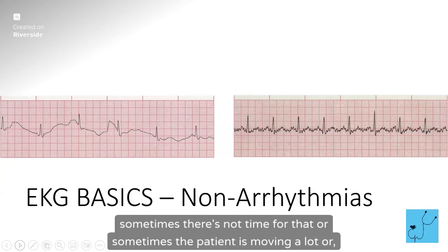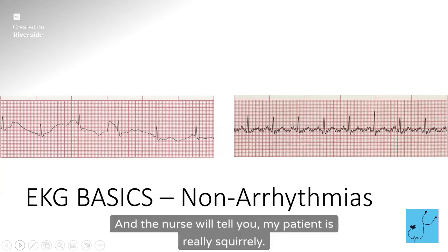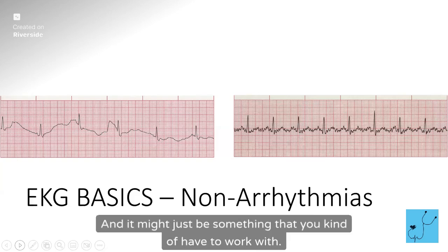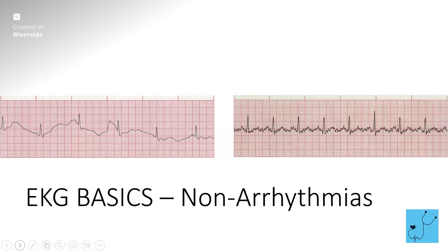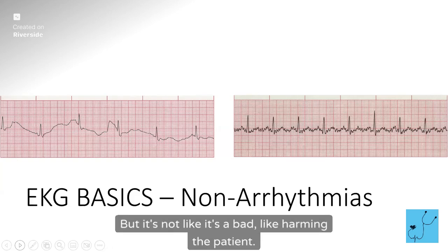Sometimes there's not time for that, or sometimes the patient is moving a lot. The nurse will tell you, oh, my patient is really squirrely. They're moving all over the bed, and it might just be something you have to work with. And when you see a good one, you're like, oh, I need that one to measure. So that's just a point of communication, but it's not like it's harming the patient.